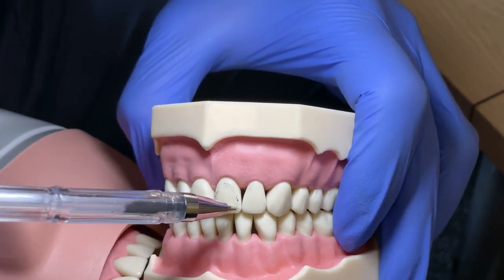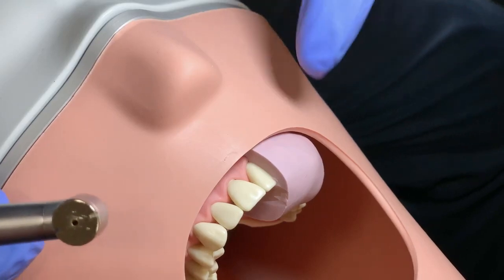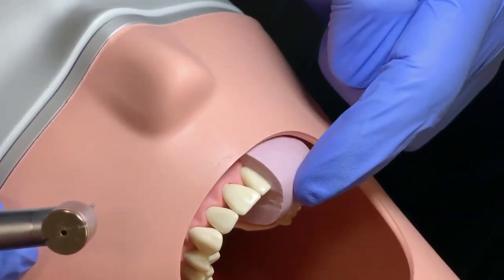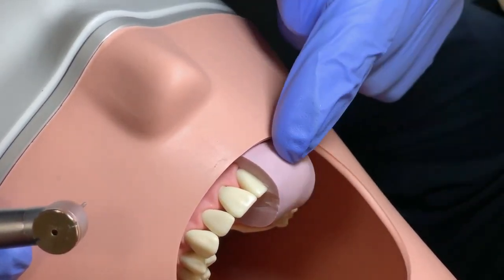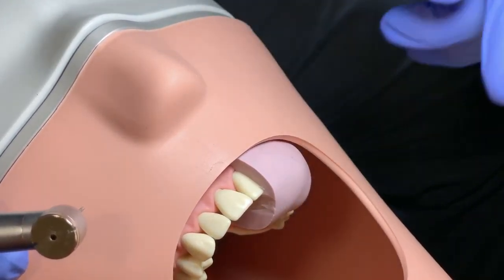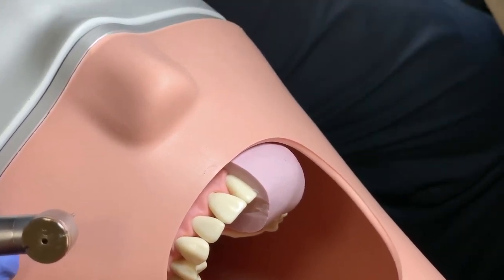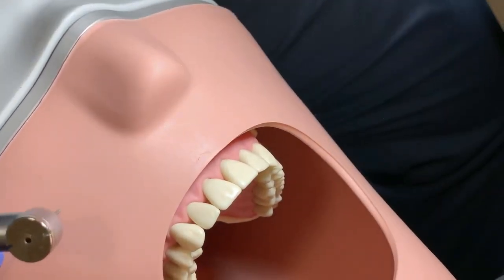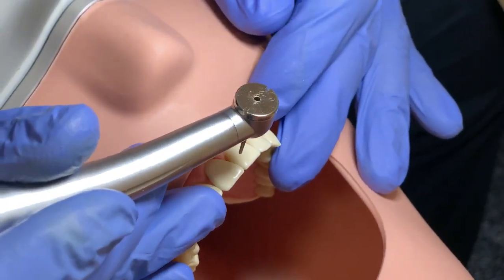This movement of the bur is very important. It's critical to cut and make a decent index — a putty index — and always remember: the more you use your putty index, the better results you will get. Always do not cut too much from the teeth. When you cut for around 30 seconds to one minute, just take it out and check again. Always check again. Now we will start demonstrating the bur angulation we discussed.